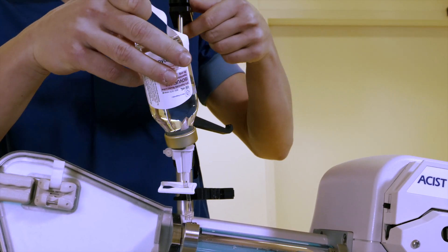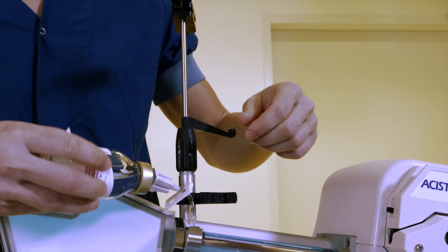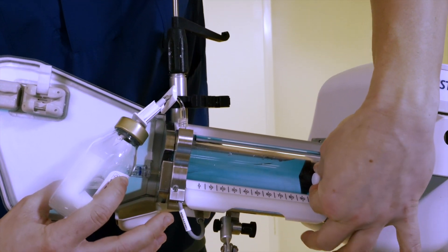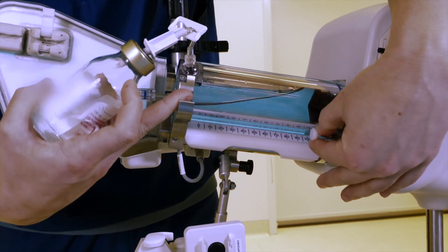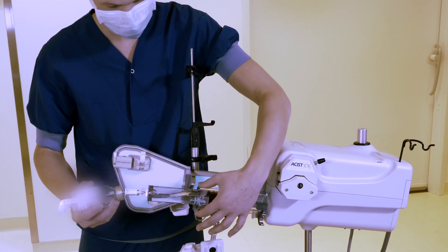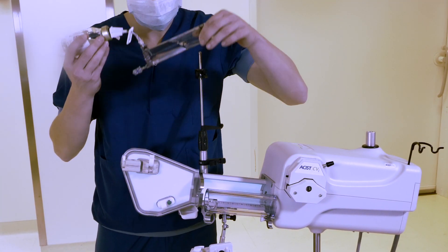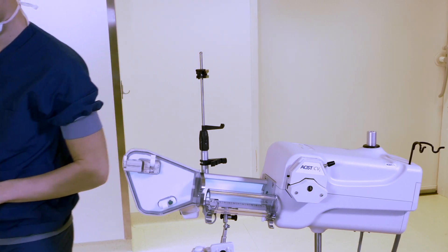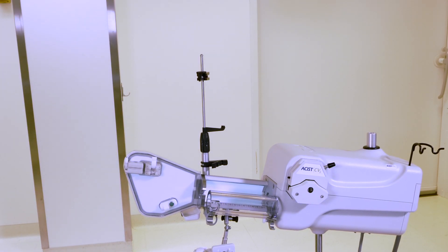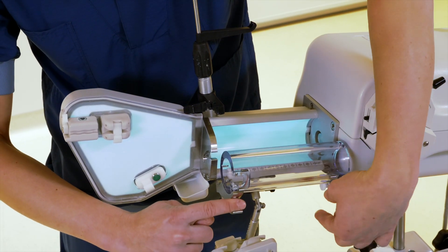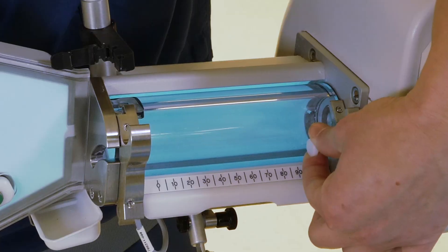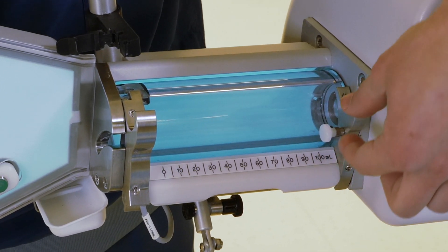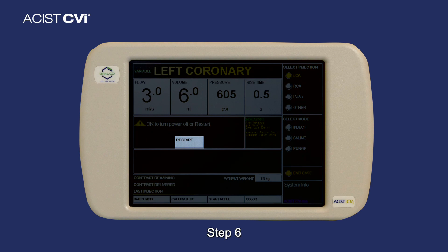Then close the syringe chamber. Step 6: press Restart.